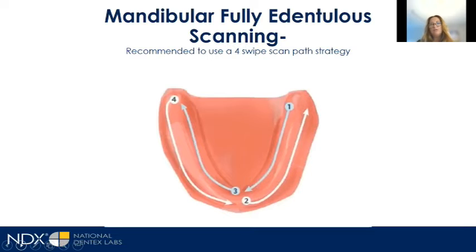So we're going to get into talking about edentulous scanning. To begin with, it can be a little upsetting because if you're used to scanning for a crown, it takes a little bit longer, but once you get the scan path protocol down, you will be able to get away with it.